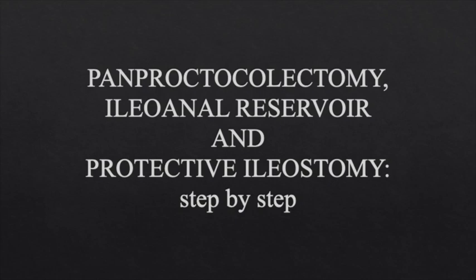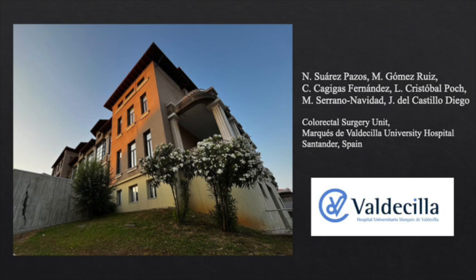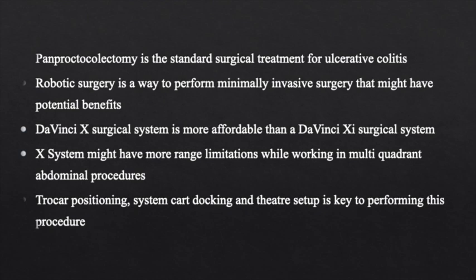Here is a video explaining a DaVinci X-Platform pan-proctocolectomy procedure with an ileoanal reservoir and protective ileostomy. Pan-proctocolectomy is the standard surgical treatment for ulcerative colitis. When possible, the preferred approach should be minimally invasive.